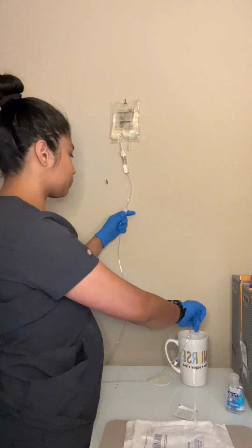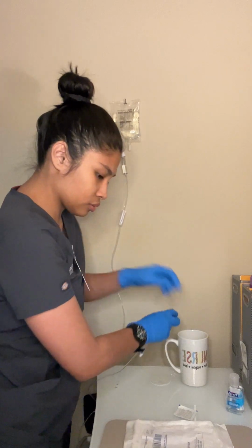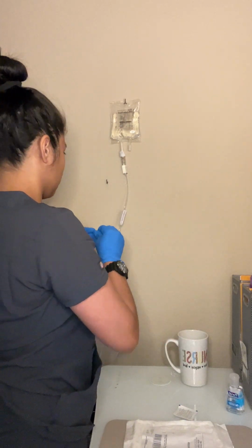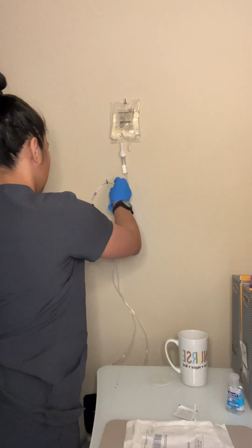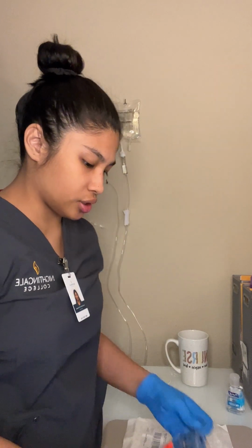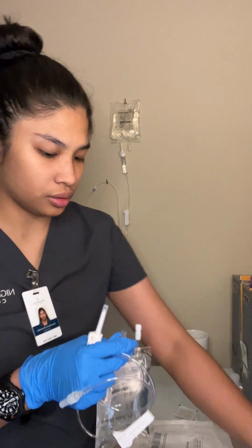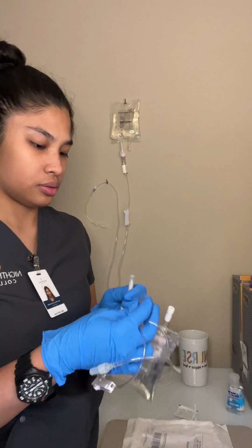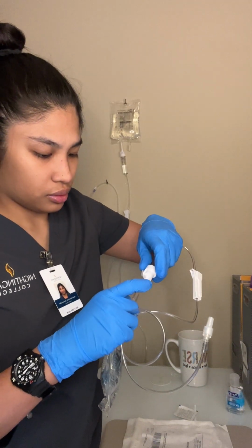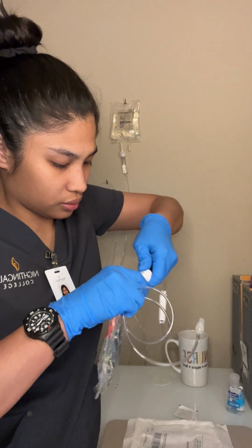Drops per minute. For the meantime, let's clamp this off. Now let's prepare the medication. Same thing, take this off. Making sure it goes all the way in.